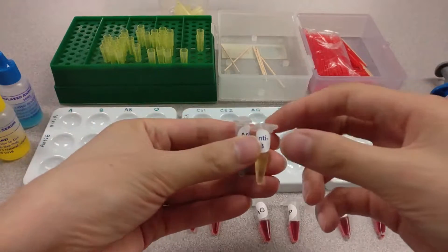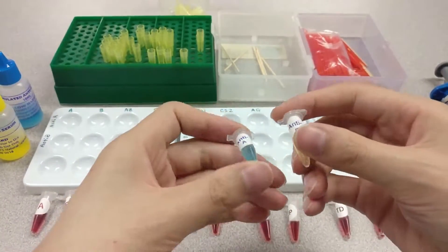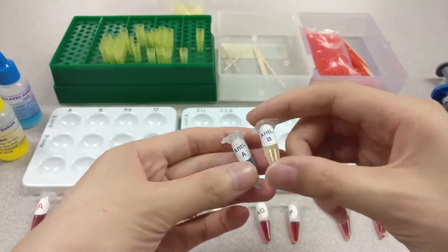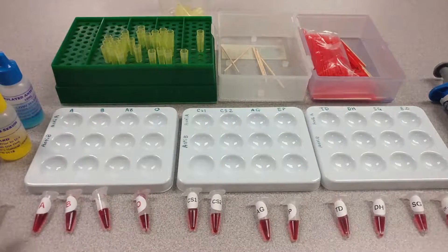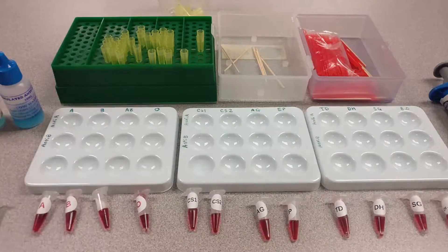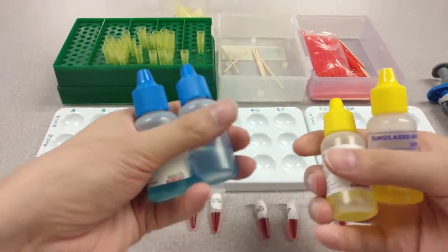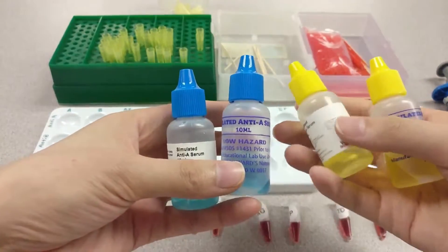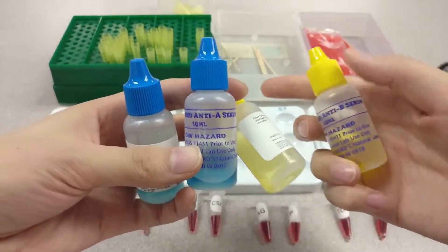Over here I have these anti-A and anti-B serums. I put them in here and then I realized I'm going to need a lot more than this to go through all of these. So I took out these, which I already had prior to this summer. This is anti-A and this is anti-B.